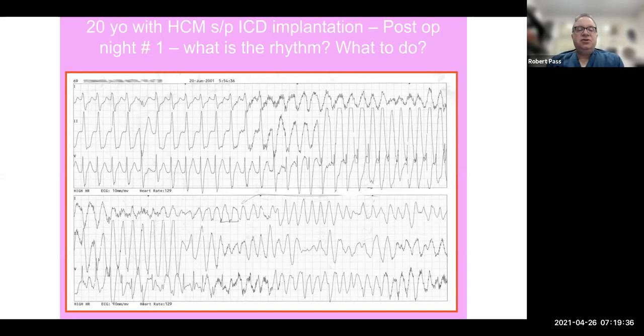But the manufacturer of this device, which happened to be a Boston Scientific device, uses a technology called an integrated bipole, where they basically have an electrode at the very end, and the other electrode is the actual coil towards the end of the lead. And so the distance between the distal electrode and the coil is a little longer or wider than in a typical pacemaker lead. It's about 2 or 3 times as far.